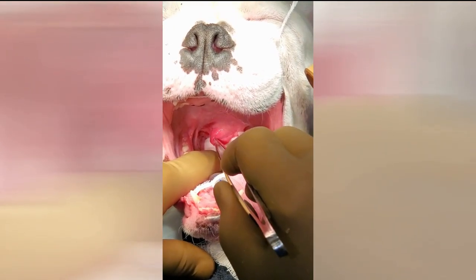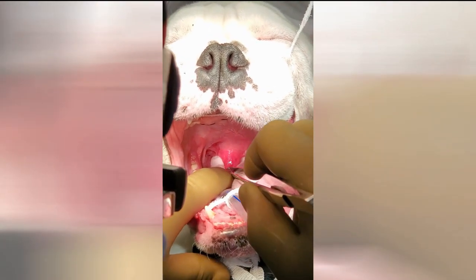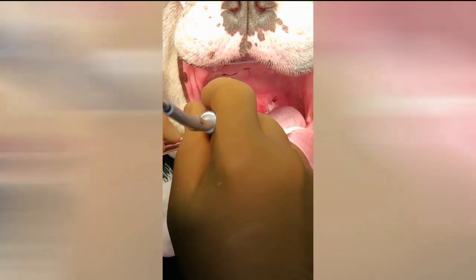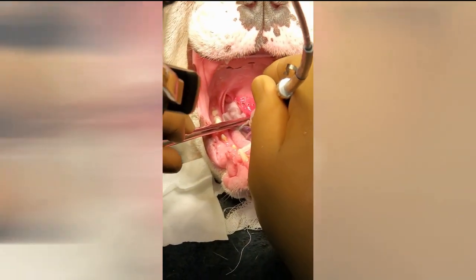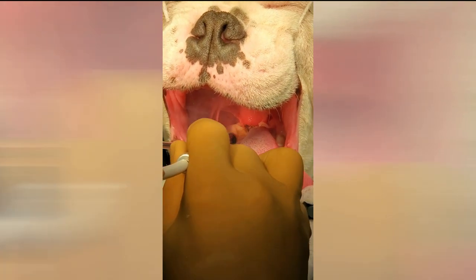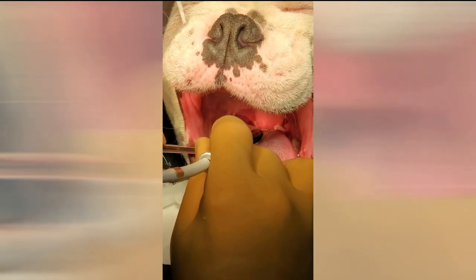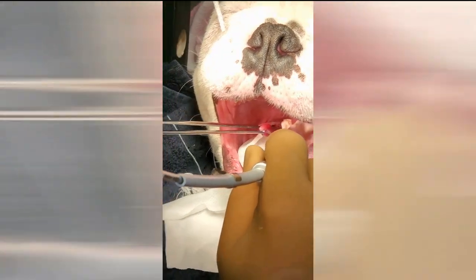So we're going in with the laser and we're going to cut back the soft palate. You can see I'm pulling it down right there, getting ready to make a laser mark on it. The problem with this particular procedure is that sometimes there's soft tissue that hangs up way up behind there, and it gets so thickened that it is very difficult to predict how much of that you're going to have to take off. Basically, you're trying to make a line that goes straight across to open up the airway.